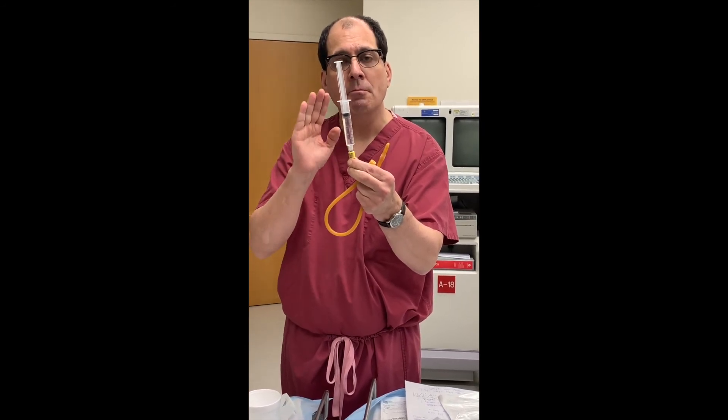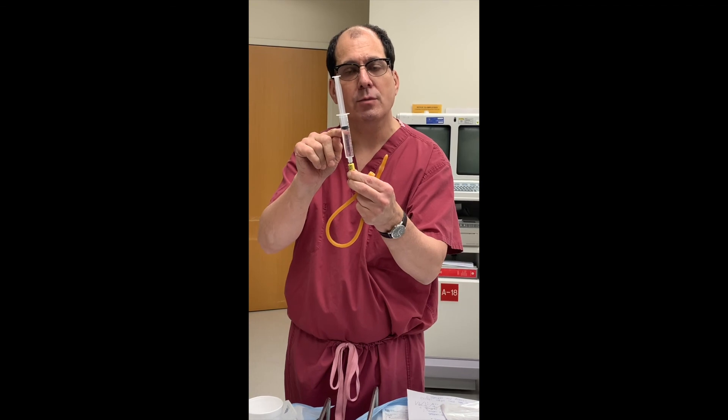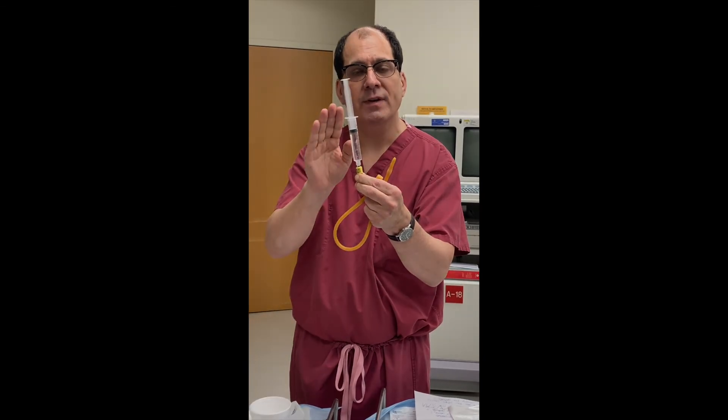Most people fill the balloon with seven to ten cc — that's seven to ten milliliters of water. That's how much fluid you need to pull out before removing the catheter.